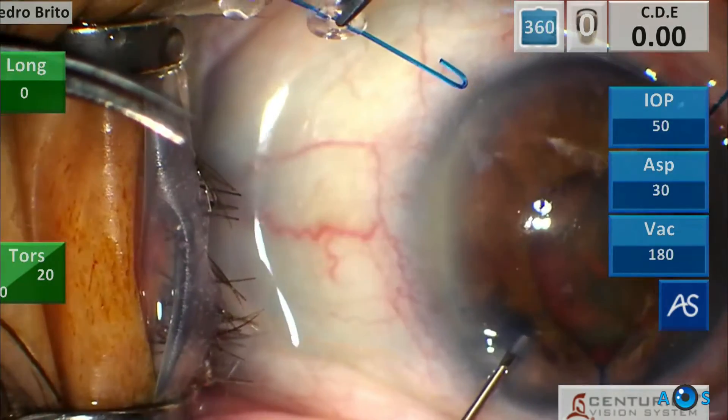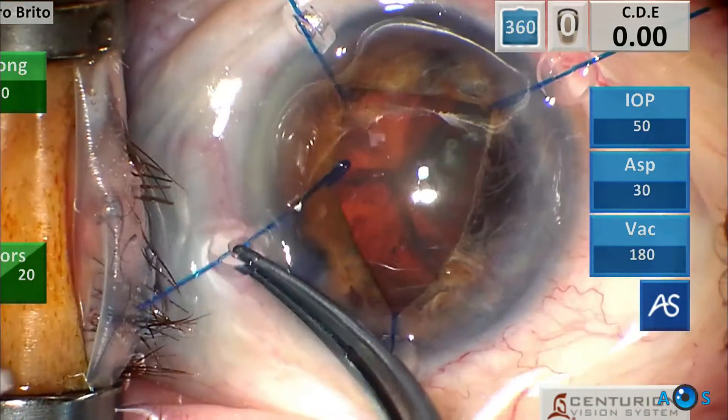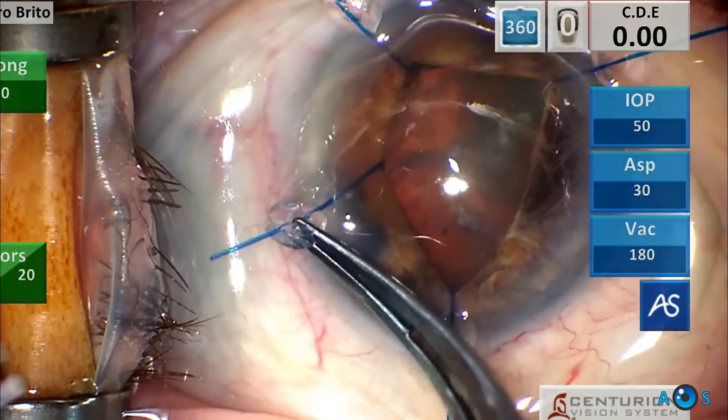Therefore iris retraction hooks will be placed. Usually about four of these hooks are used in order to create a somewhat square-shaped pupil.